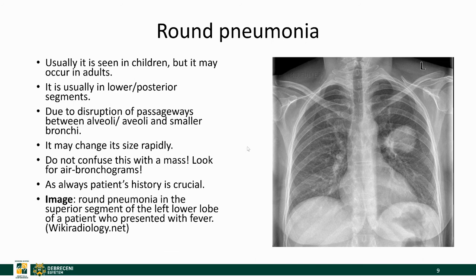Round pneumonia is more common in children, though infrequently we see it in adults as well. It usually appears in a lower posterior segment. As you can see here, it appears like a mass, which can be a little bit menacing. However, it will contain air bronchograms and its size will change quite rapidly. It's important to know the patient's history. Here you can see a round pneumonia in the upper segment of the left lower lobe — the sixth segment of the left lung.